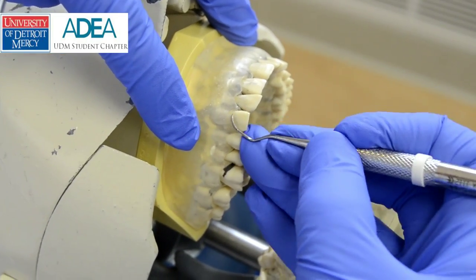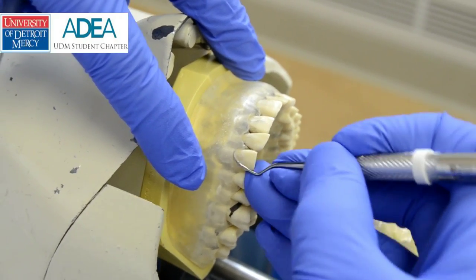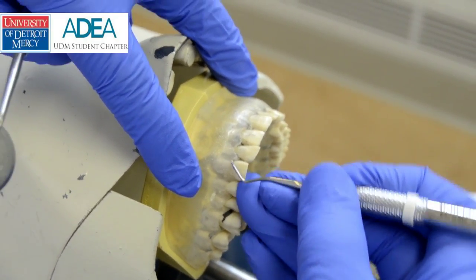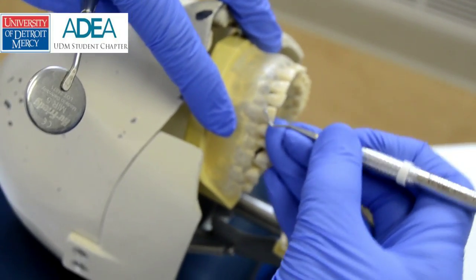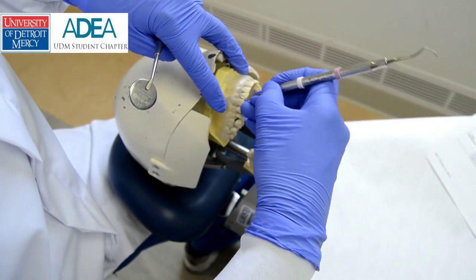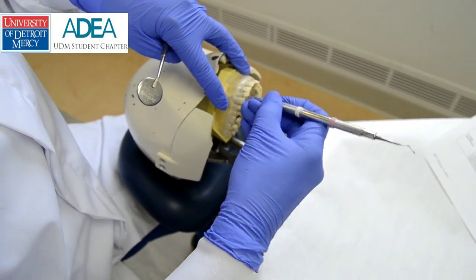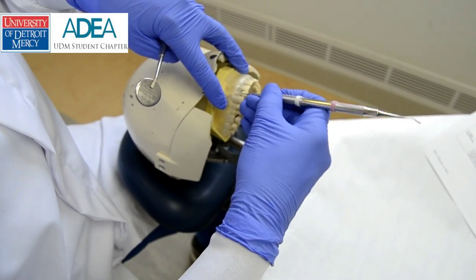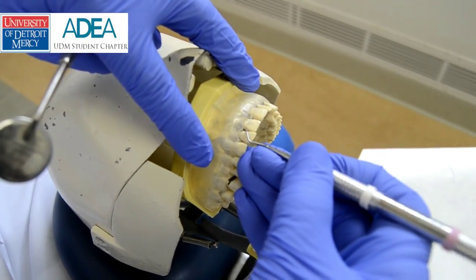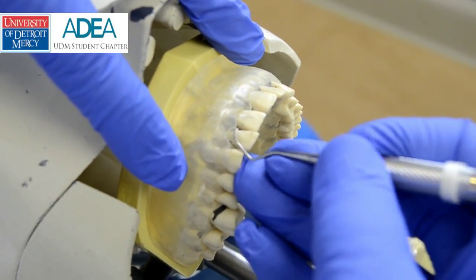Starting at the midline, I'm going to rock on the fulcrum — that's what creates my working stroke. Rolling to the inner proximal and then creating my front-to-back stroke. This is side to side on the facial, rolling, and then front-to-back stroke. You'll notice you can't get as far into the proximal because of the rounded toe, so I won't be able to get very far through a tight contact point.